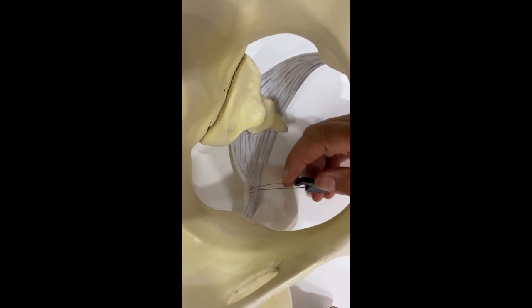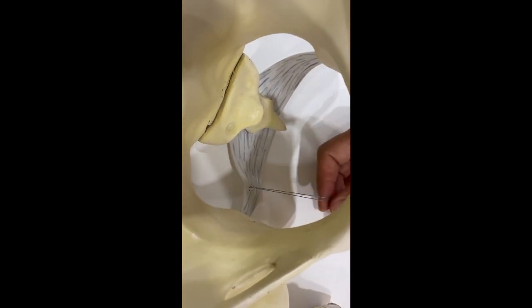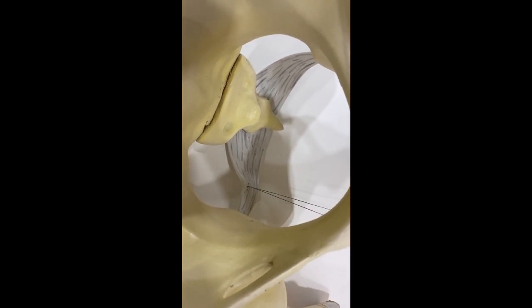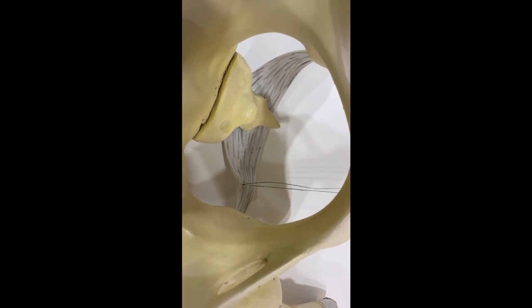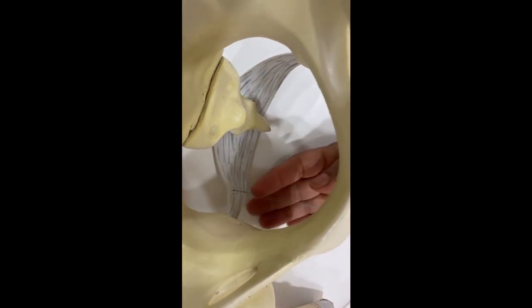Withdraw the instrument gently. Now you have the two ends of the thread out of the vagina. Check that the suture was taken at the right spot on the ligament, and then take another bite into the ligament for stronger fixation.